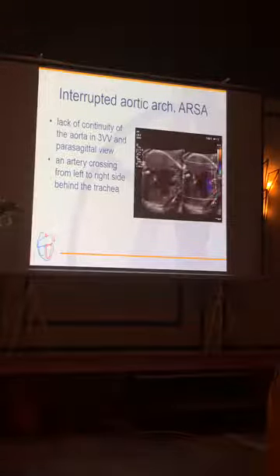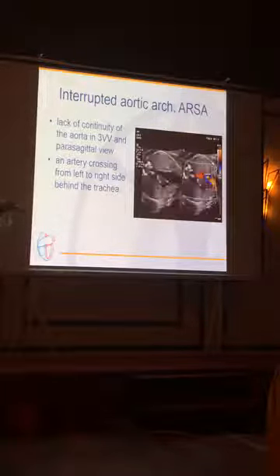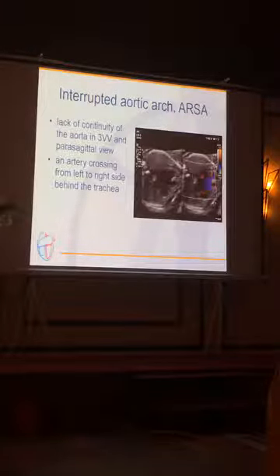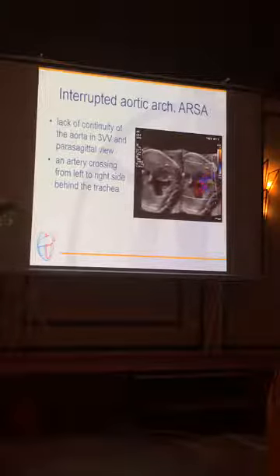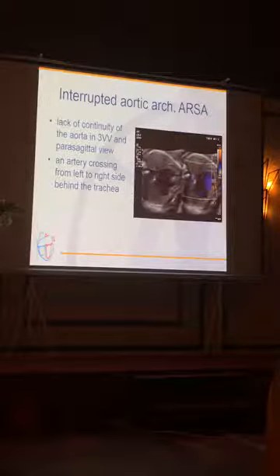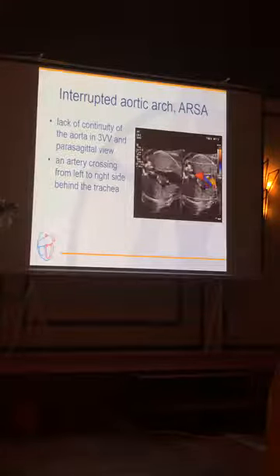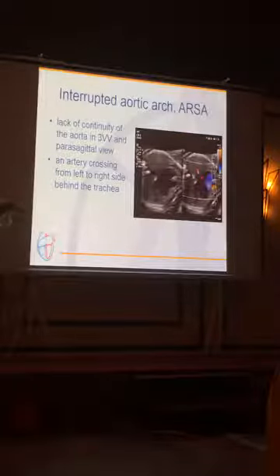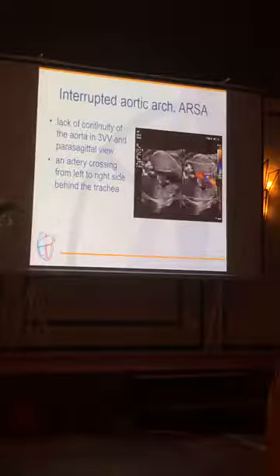And in the heart, what's visible quite often is this ventricular septal defect. And this is very special. So what is special about this defect that you can see in this image? Shunting, yeah? This is unidirectional shunting left to right. And it is quite unusual for fetal scans. So it's very suggestive of some aortic arch problems.